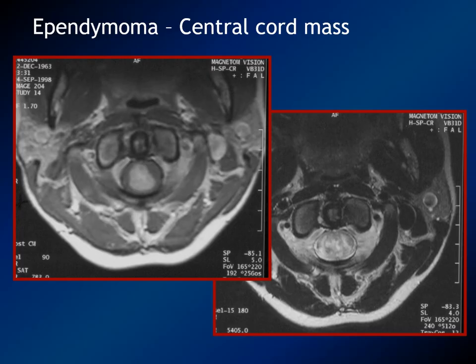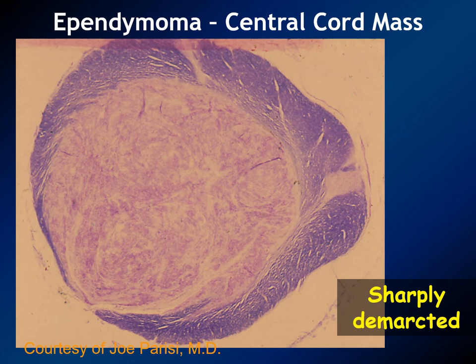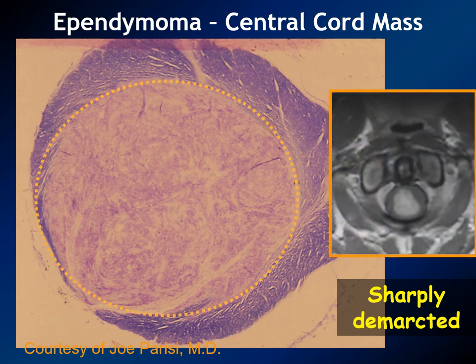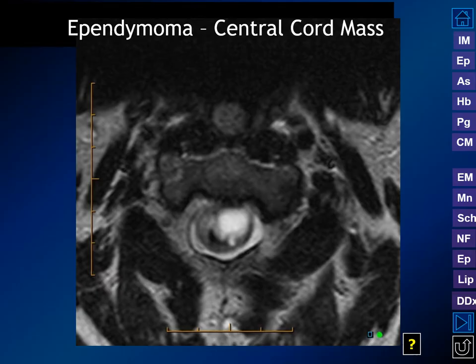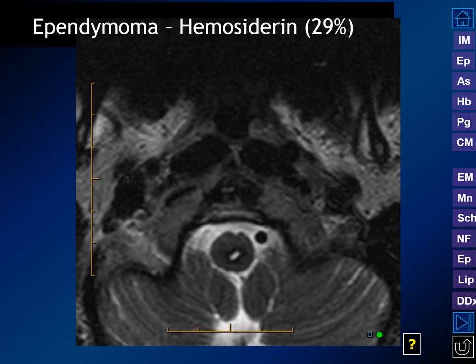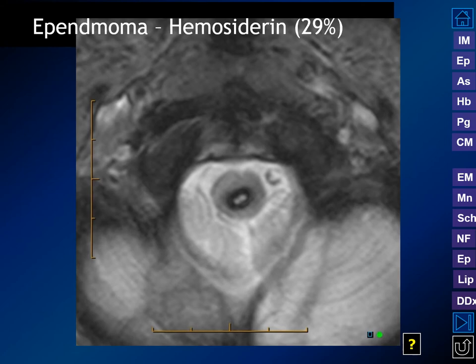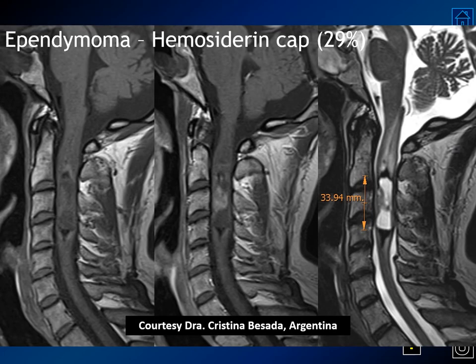On axial images, ependymomas are most commonly centrally located masses because they arise from the lining of the central canal — ependyma. These images from two different patients illustrate the sharply demarcated central location. We can see hypointensity around the rim representing hemosiderin, and hemosiderin surrounding the cyst or syringohydromyelia. Hemosiderin in an adult patient with a cervical cord mass is suggestive of ependymoma. Here is another ependymoma again showing the hemosiderin cap at the top and bottom.